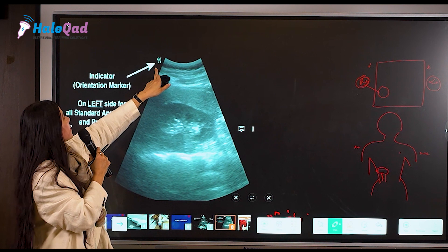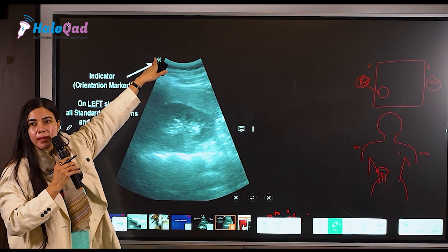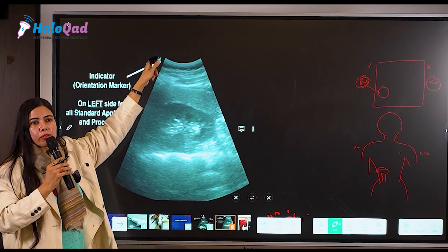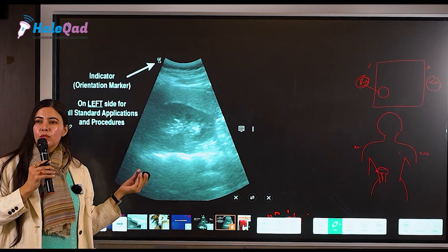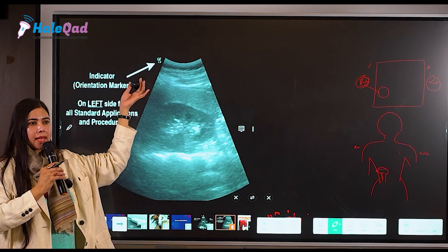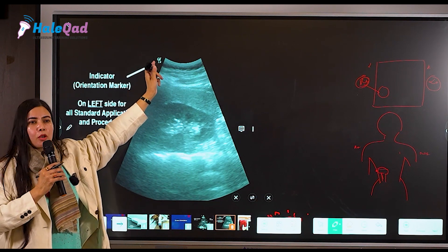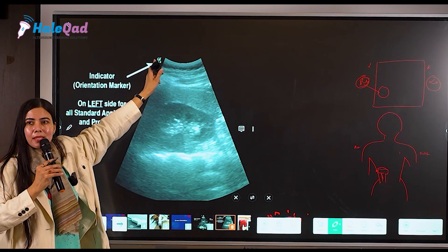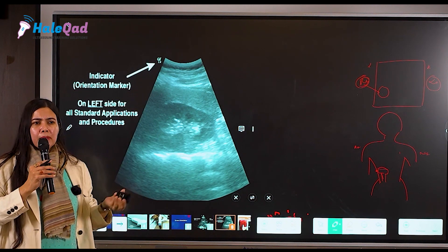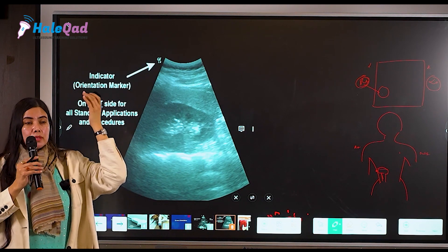There is a point on screen that indicates your probe marker position, so you can check that as well. When we are doing scans, we are often in a hurry — the patient comes in, lies down, and you start scanning right away. Take a few seconds to glance at the screen — this is very important because when you're busy with the patient and distracted, you can easily skip these orientation checks.